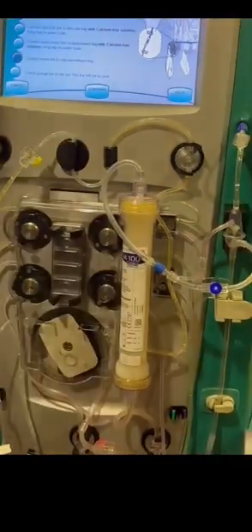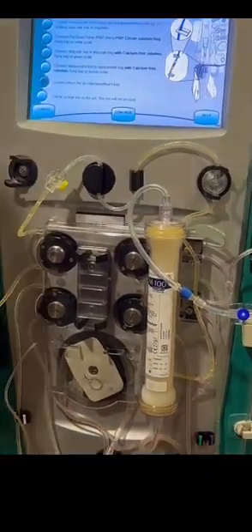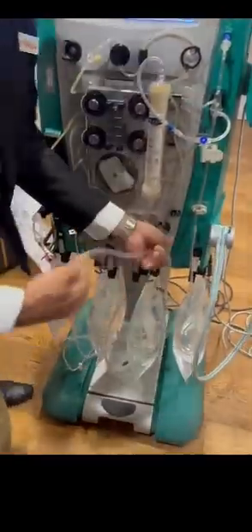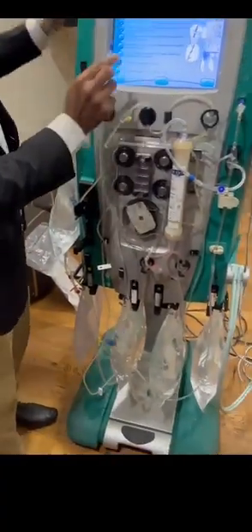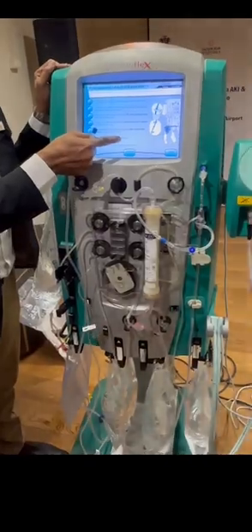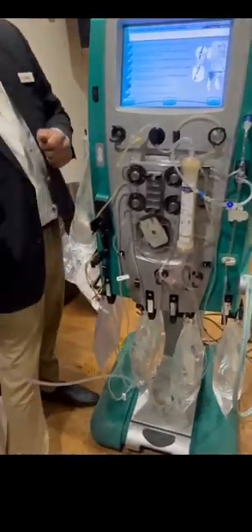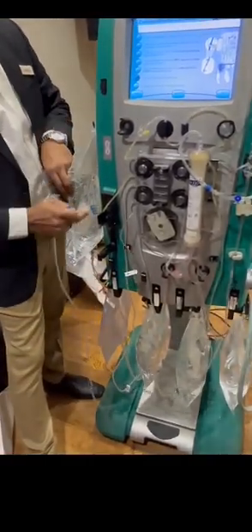This is Prismaflex. So we can connect the return line. Now this line is not connected anywhere. I will tell that. So now this line is free. What it says is connect the return line to the collection or effluent bag. So this is the effluent bag. For the therapy time, this will connect to the patient, and this yellow line also will come here. But temporarily, for the priming only, we have connected like this.